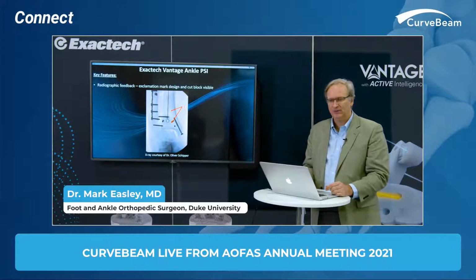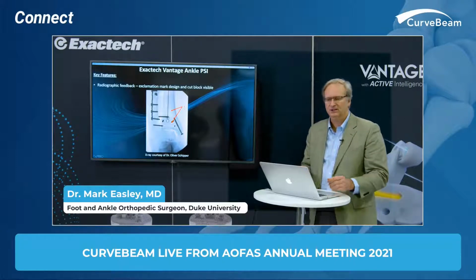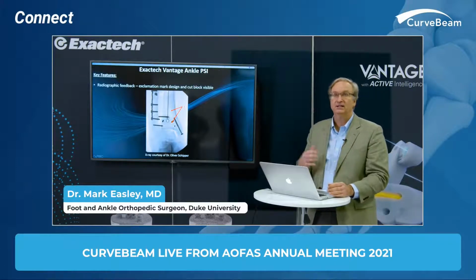But you can see, I can see right through the block, and I can see the cut surfaces there. If you can see the mouse there, here's where my cut's going to be, and that's been planned out. I love this because it's a great visual, and ideally, obviously, we want to get to the point where we don't need to do fluoroscopy. But at this point, I'm still a belt and suspenders type surgeon, but I've been amazed at the accuracy of this technology, and the weight-bearing CT helps me get it aligned to where I need it to be.